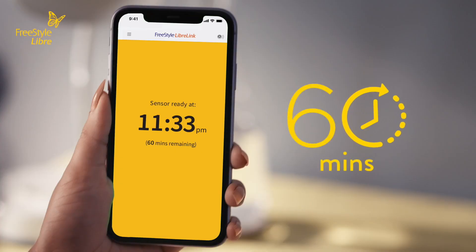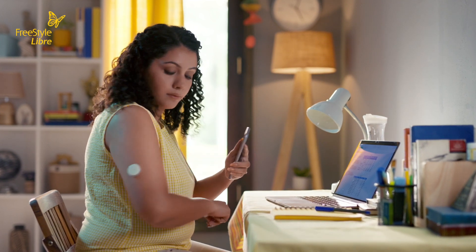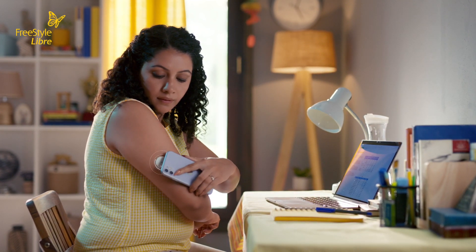You have to wait 60 minutes before your sensor is ready for scanning. There will be a countdown on your screen. Once the countdown is complete, you can scan your sensor to get your first glucose reading.